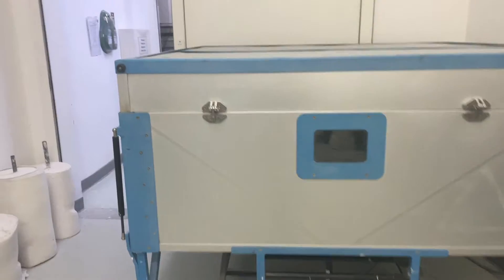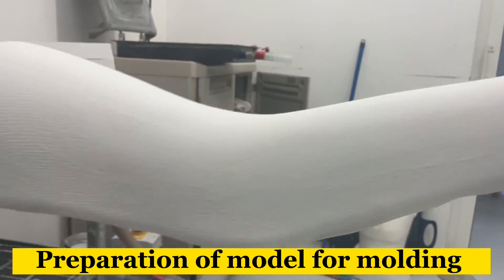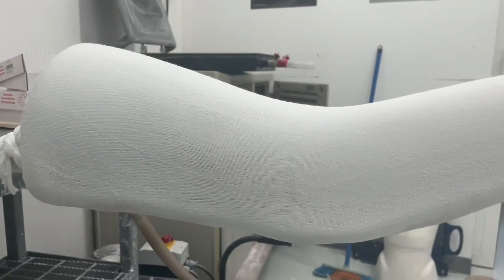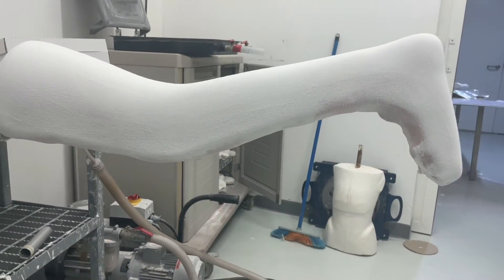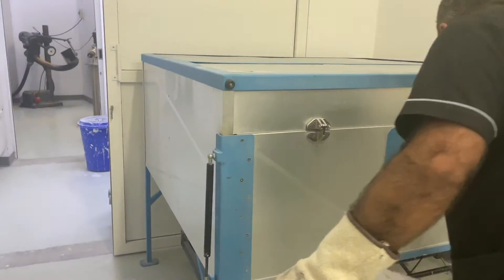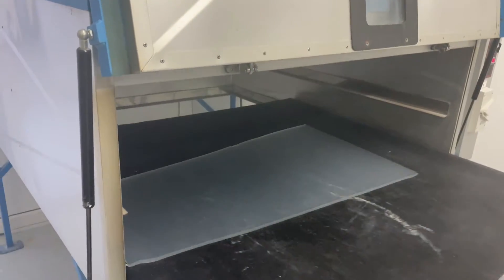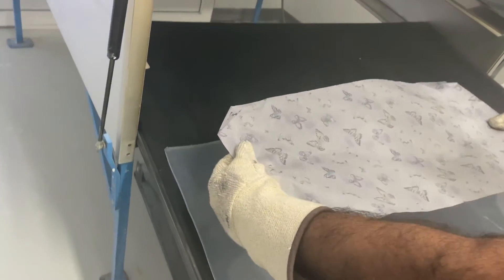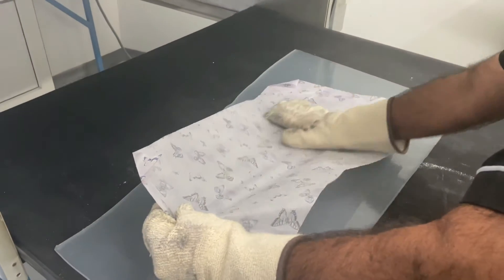While the material is getting ready for molding, on the other hand we need to prepare the model. The first important thing is the model should be dry. We need to put some stocking nets over to cover the model, and we need to add some parting agents — we can put talcum powder. This will help in removing the plastic sheet after molding.